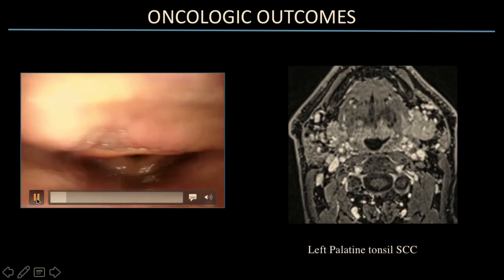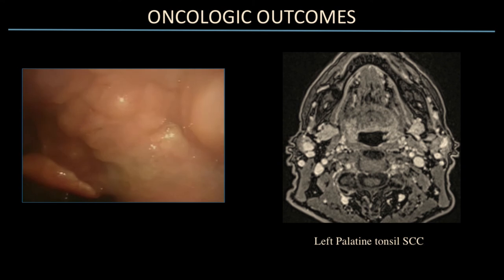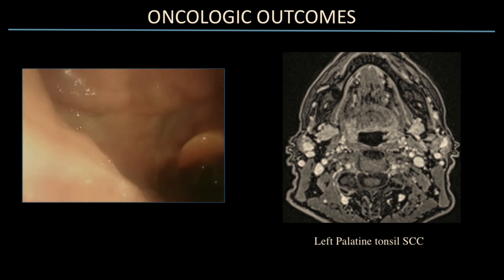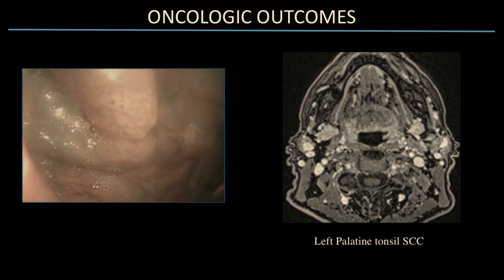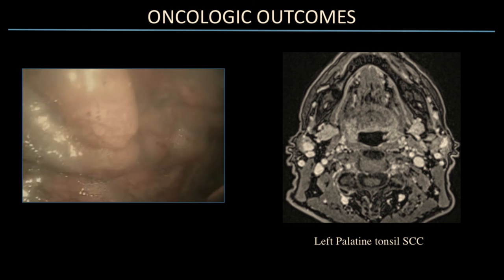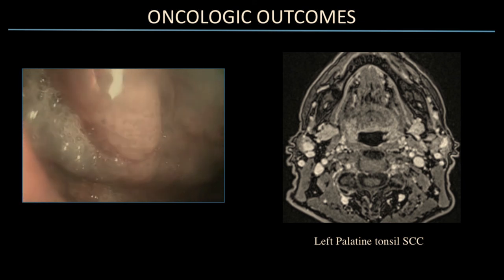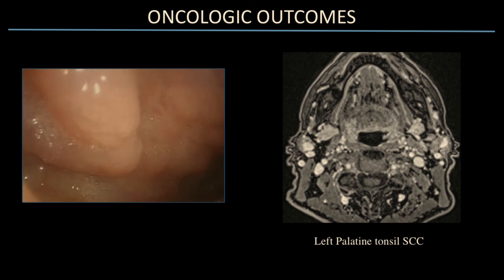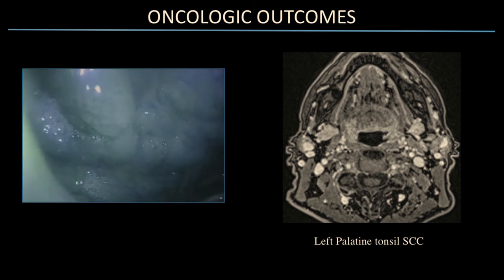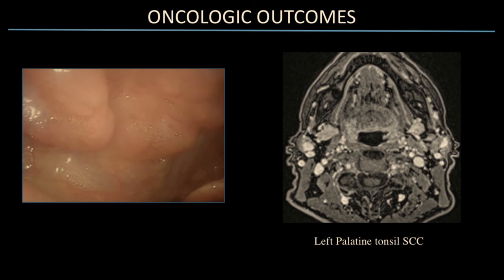In another case, MRI was negative and white light showed no suspicious area. It does take more time to explore the base of the tongue and requires patient compliance, but moving closer to the mucosa and switching between white light and NBI multiple times allows you to recognize the lesion. It is also important to clean the mucosa from secretions, after which you can clearly identify the dark spots of the tonsil.